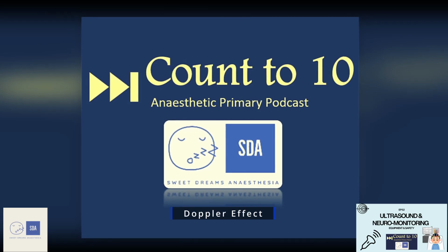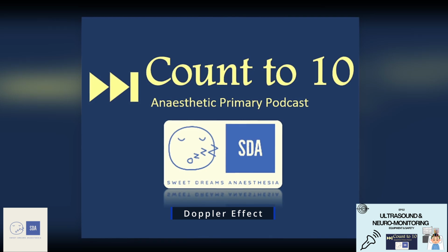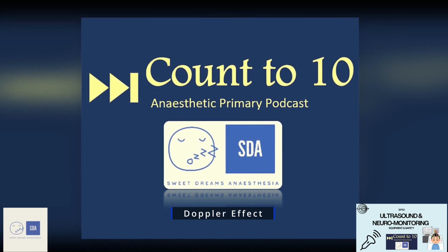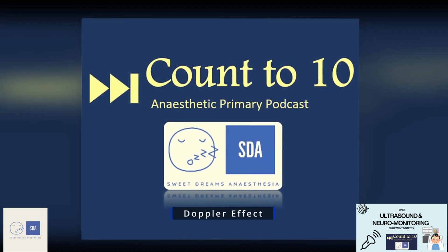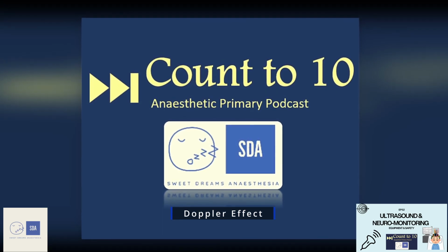You might be familiar with the Doppler effect as the effect that we refer to when we hear an ambulance coming or hear a train on the platform. What it describes is the change in the observed frequency when a wave is reflected off a moving object relative to the position of the receiver.